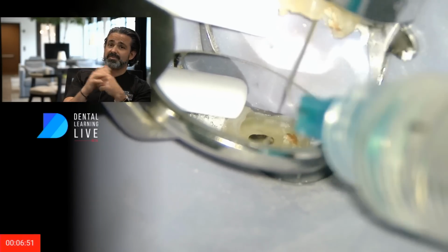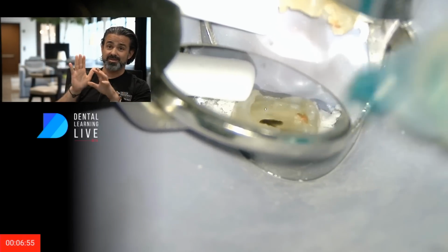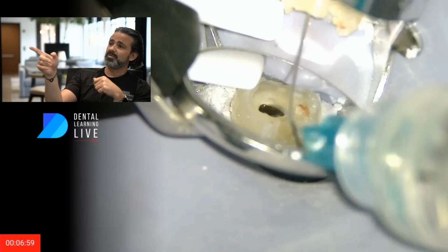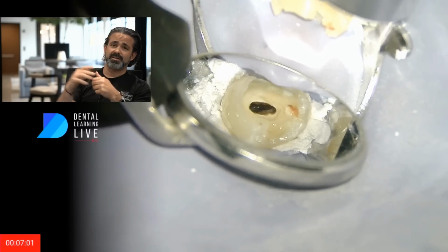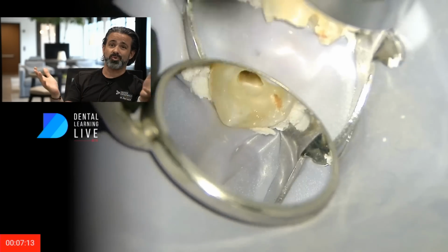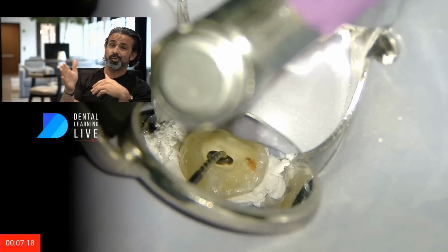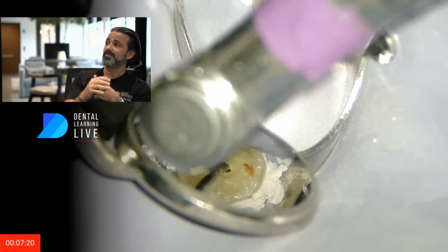And sometimes this can be really frustrating. Fortunately, I have a fantastic patient right now. They're not budging. Now, if you look on the screen, the little red box down there that's counting away is actual working time. So 7 minutes.